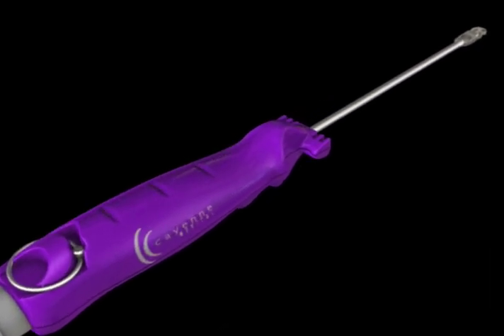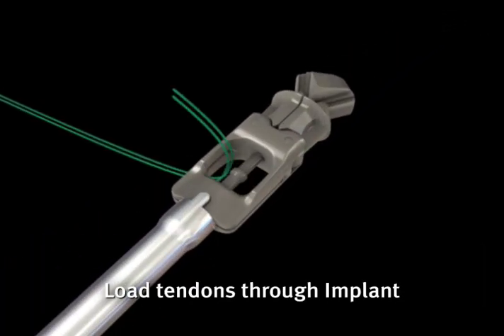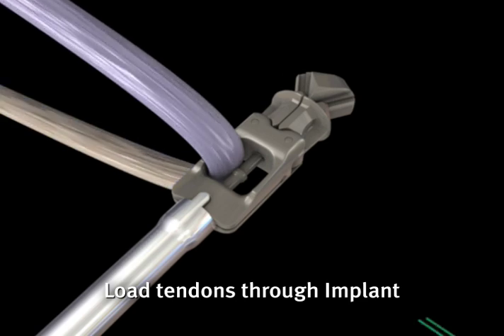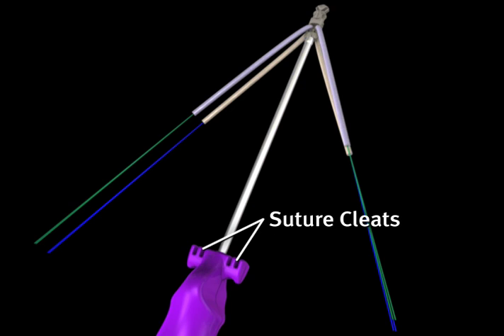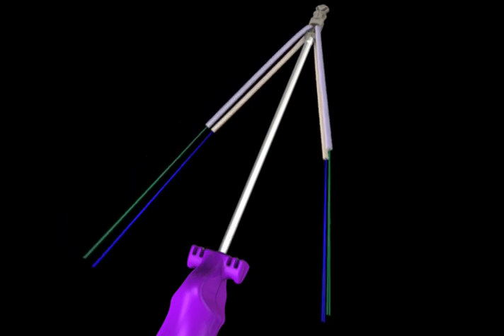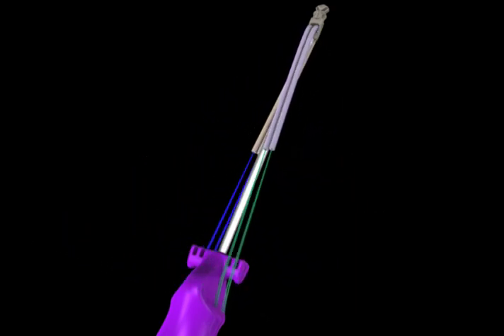The prepared soft tissue graft strands are then passed through the openings of the Apofix femoral implant. Once the grafts are seated in the implant, the whip-stitched sutures from the ends of each are wrapped around the suture cleats located at either end of the inserter handle.